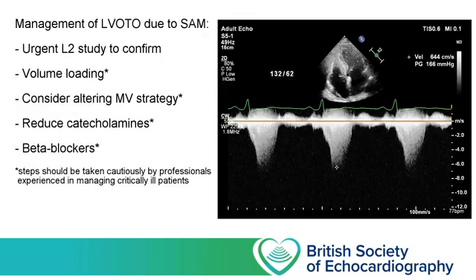The detection of possible SAM in an acutely unwell patient should prompt referral for an urgent level 2 study, to confirm the diagnosis and measure the pressure gradient across the left ventricular outflow tract.